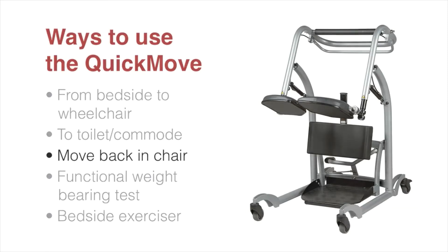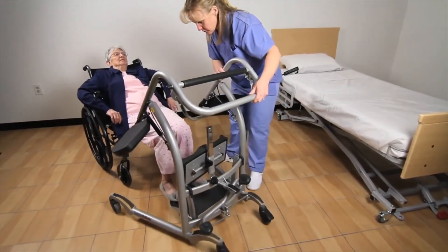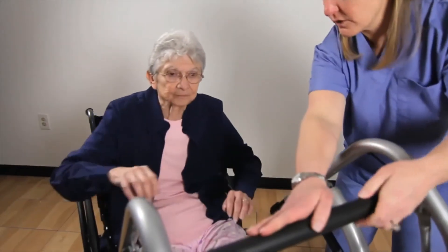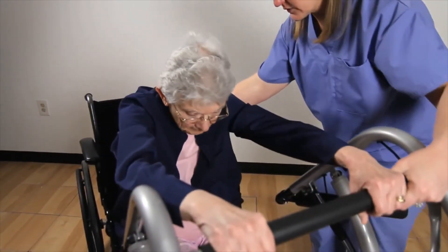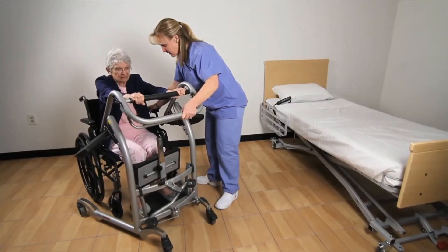Another benefit of the Quick Move is helping someone move back into their chair position. Place the Quick Move in front of the chair and ask the patient to place their feet on the footplate, then ask the patient to pull themselves up so they are not touching the seat. Then push the Quick Move forward, placing the patient back into the chair.